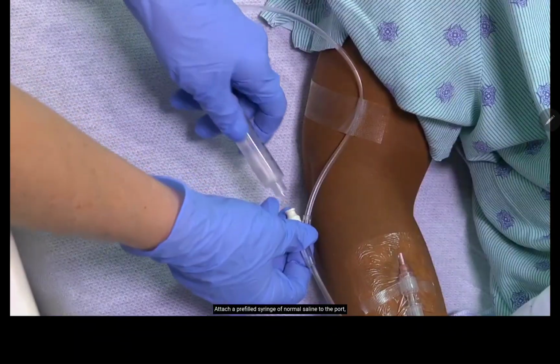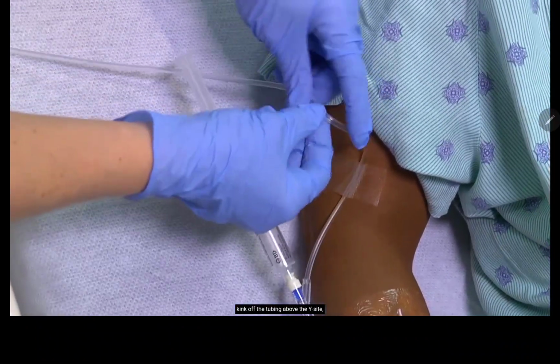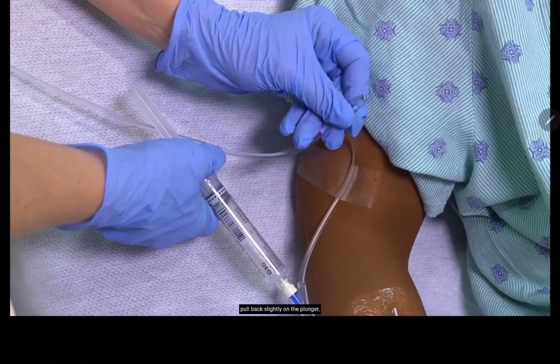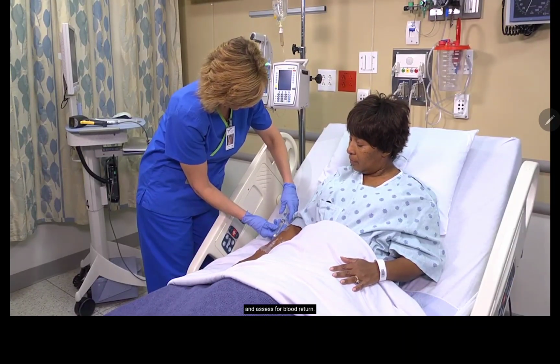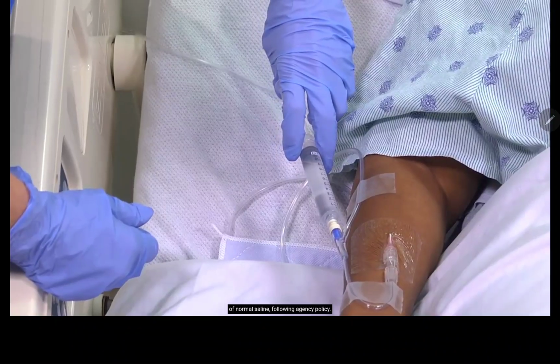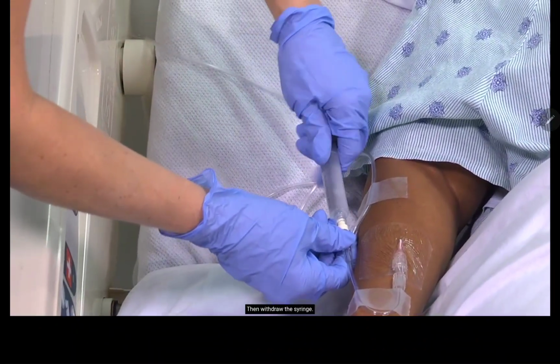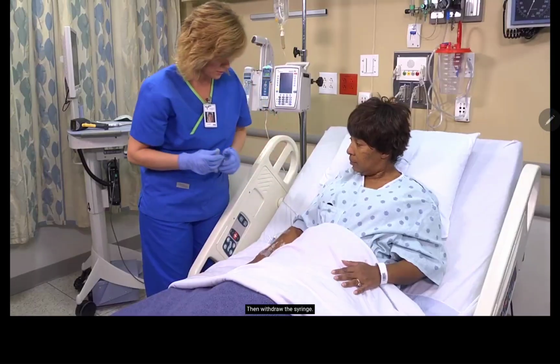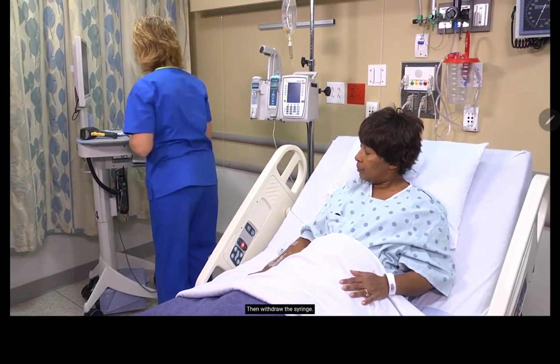Attach a pre-filled syringe of normal saline to the port. Kink off the tubing above the Y site, pull back slightly on the plunger, and assess for blood return. Then slowly flush the line with 2 to 3 milliliters of normal saline, following agency policy. Then withdraw the syringe. Looks like it's working fine. We're going to get that antibiotic hanging now.